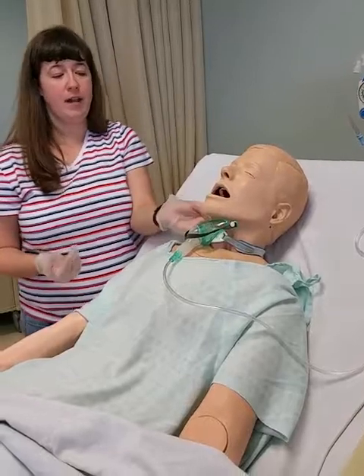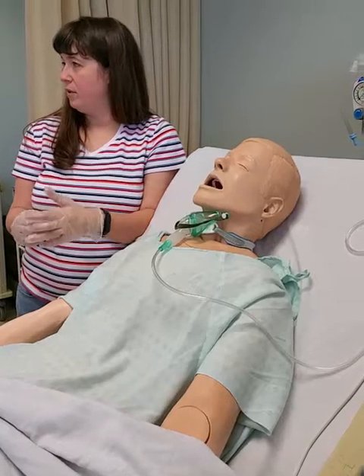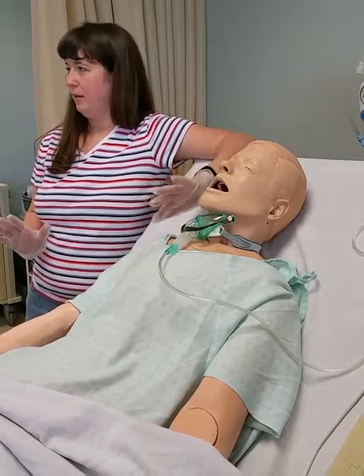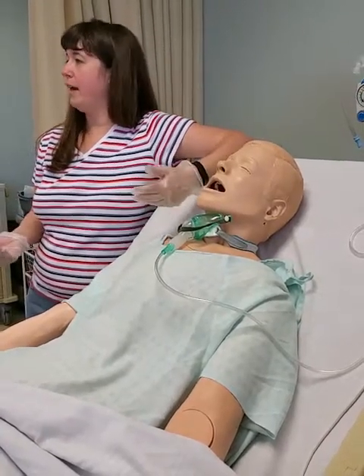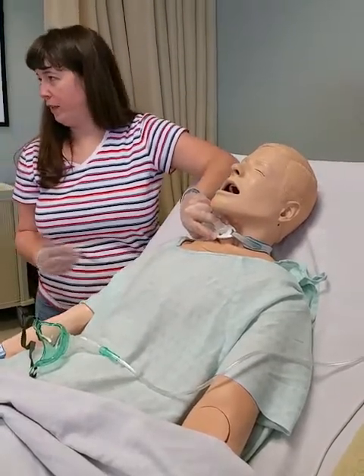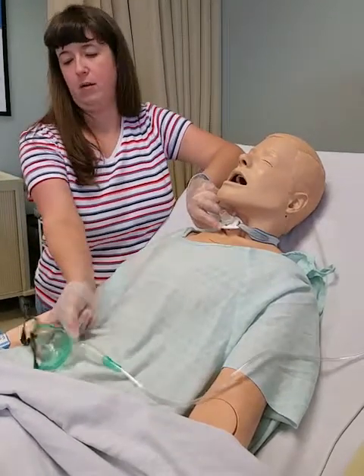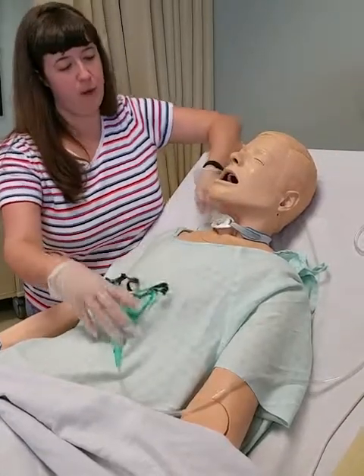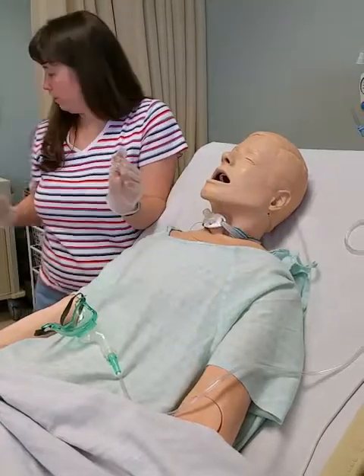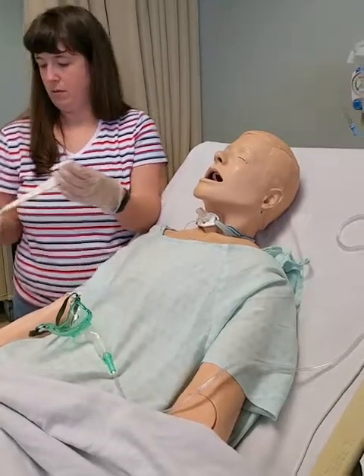So, like we talked about in class, in order to prevent decannulation, I don't want to take the old trach ties off until I've got the new ones on. Now, if the old ones are disgusting, what you may want to do is get a second set of hands to help you so you can take the old ones off and someone can hold the faceplate so that it doesn't pop out, because you don't want the two to come in contact. But if they're not that horrible, and we're going to say for CPEs they're not, what I do is I usually scoot my old ones to the bottom, and then I'm going to get my new ones. And if your hand is really gross, change gloves.